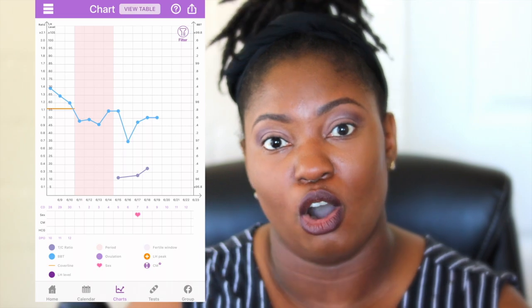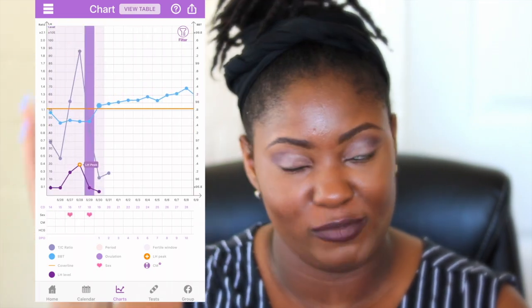Using the Premom app, I can have my BBT temperatures, my semi-quantitative OPKs, and my regular OPKs with their LH levels all together on one chart. Using all of those things together were a game changer for this last cycle.